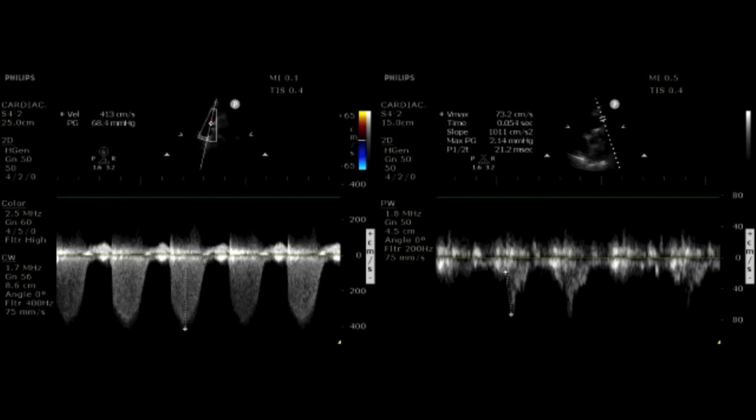Sounds good. So from my perspective, I don't think I have ever used the echo to make the diagnosis of a PE and stopped there, right? I think it always suggests the diagnosis of the PE, but most of the time I'm using it to quantify the severity of the PE, right? If I'm clinically worried, my workflow goes through either the PERC score or a D-dimer if their pretest probability is low, or a CTPE to evaluate, and then I have my answer from there.